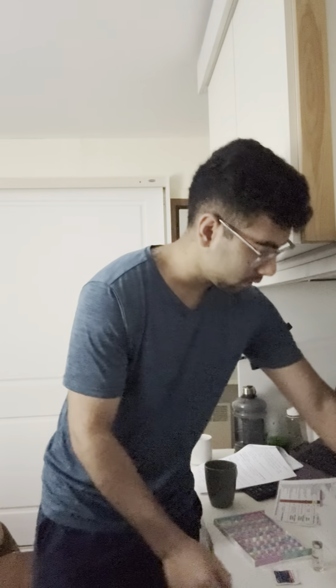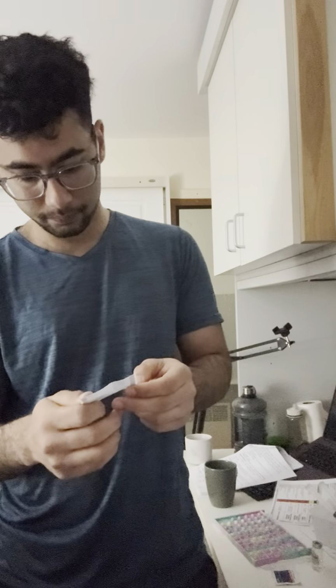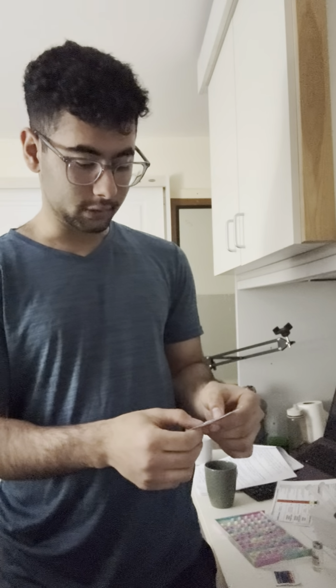So it looks like I do have the label, but as you can see here, it says what you are giving. It says the name of the patient, the one that we do for subcut as well. So ceftriaxone, we give 1 gram per 10 ml. That means the amount of medication is 1 gram, and the volume of liquid we are mixing it with is 10 ml, right? 10 ml of water we are doing that. So 1000 mg divided by 10 equals 100 mg per ml, right?